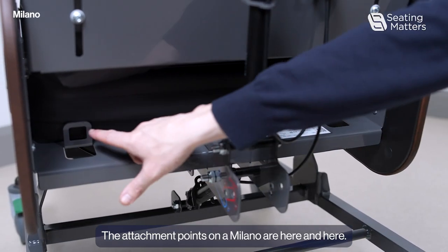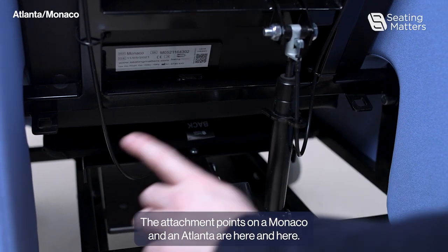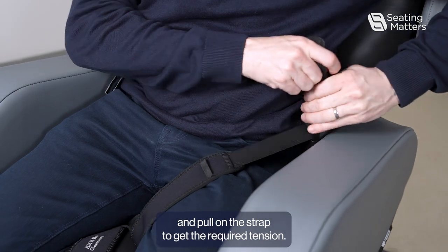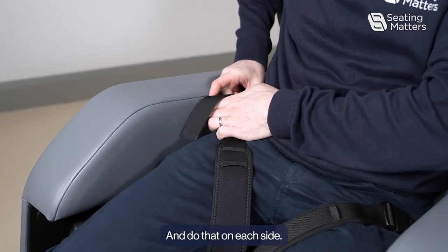We then attach the two clips on each side into the same attachment point. The attachment points on a Milano are here and here. The attachment points on a Monaco and an Atlanta are here and here. Once the patient is in the chair, you can then reconnect the clips and pull on the strap to get the required tension, and do that on each side.